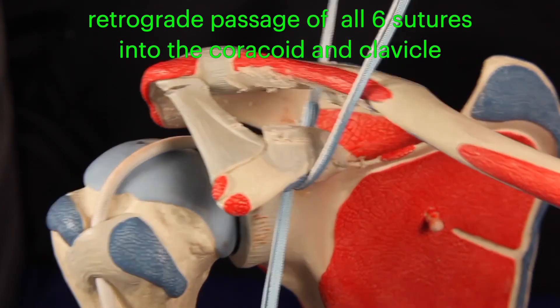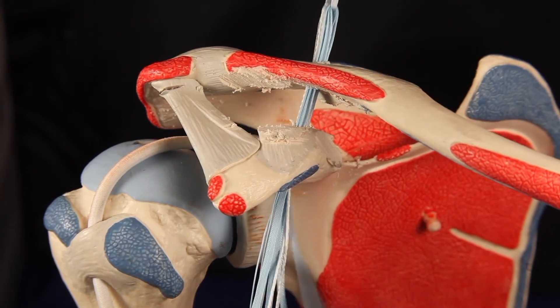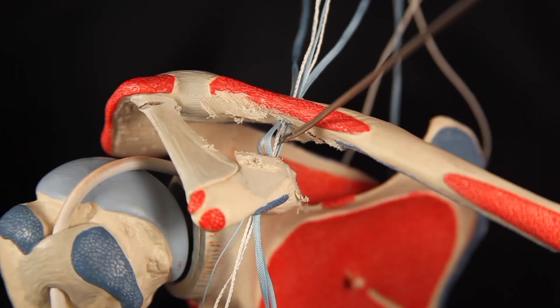All six strands of suture, not including the rescue stitch, are then placed into the passing loop and pulled out of the top side of the clavicle.